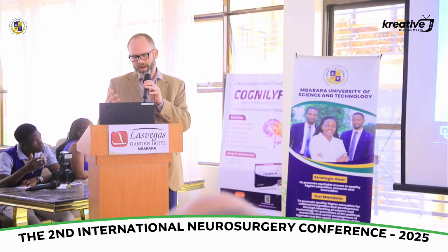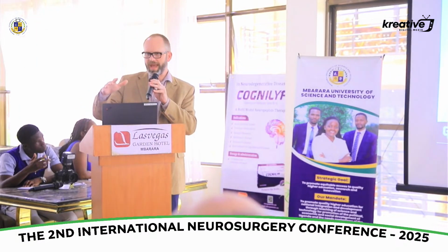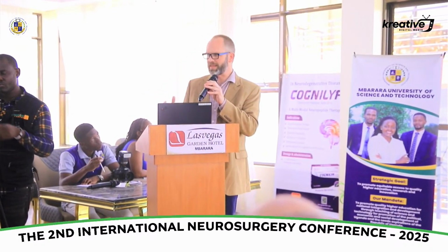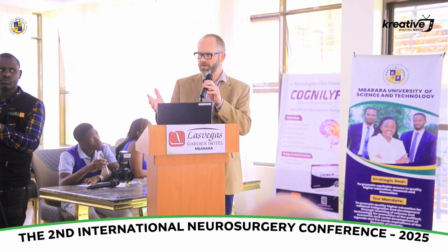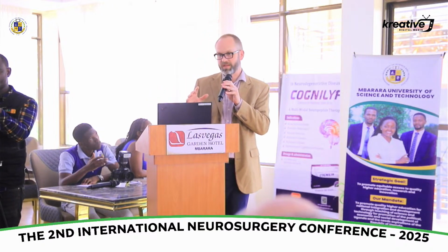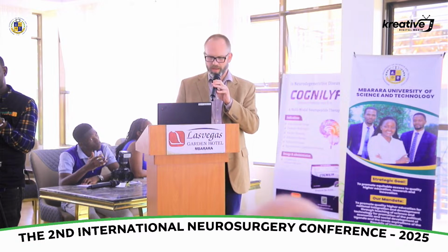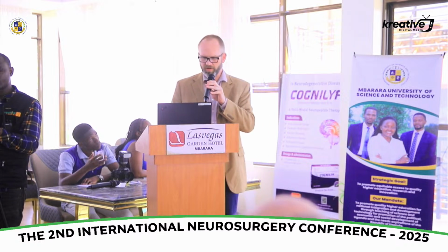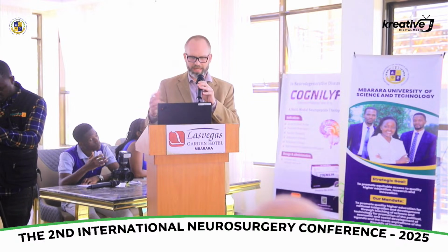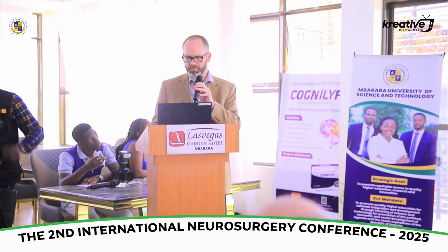And so what I recommend for people is if you have a radiologist who deals with pediatric patients with head ultrasound, having them come to the OR with you to help with interpretation early on, that's very beneficial. If that's not available, then we'll talk about some hints as to how to help you through that learning curve. But the key is to just bring it into every case, to practice, and you'll get better.